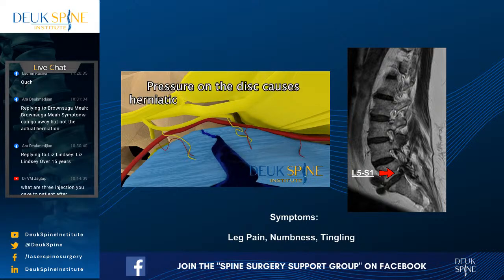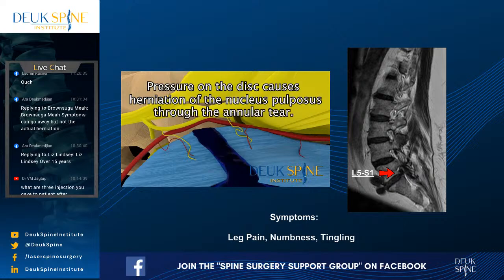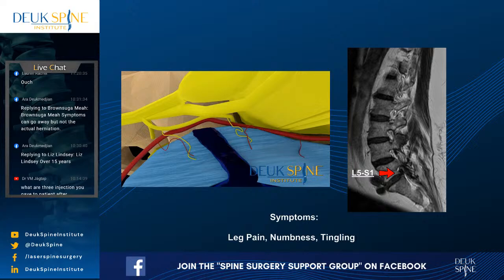Right now, I'm just feeling around. I know Dr. Patel did the piriformis, so I'm just kind of palpating. You're going to feel a little stick and burn. That's just the numbing medicine going in, okay?